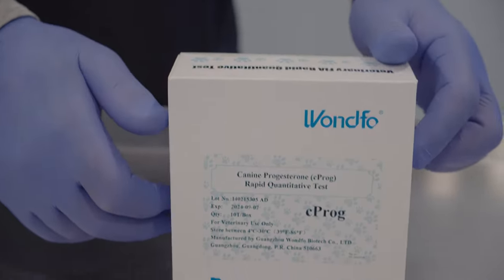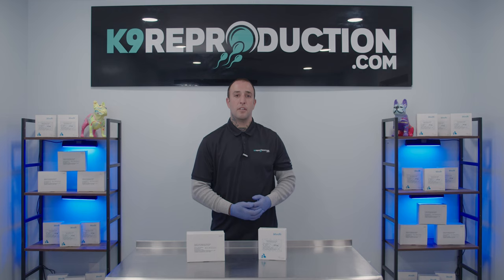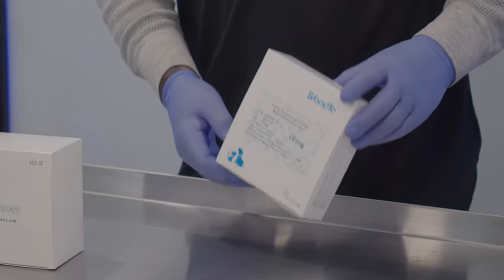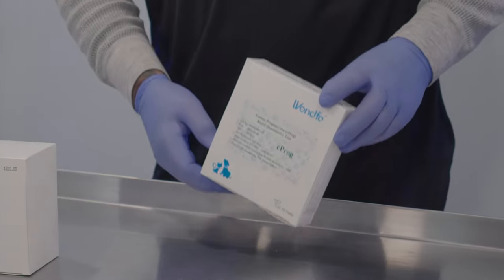With the serum tests, you still need to take the time to spin down the blood and also run the risk of having hemolyzed samples altering your results. They do come in at only $9 per test, which is a good savings, especially if you're doing testing in bulk.